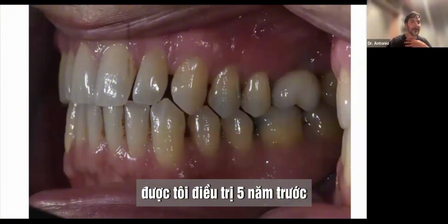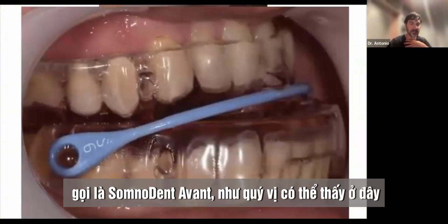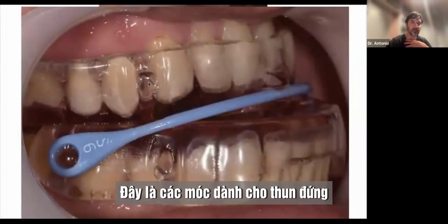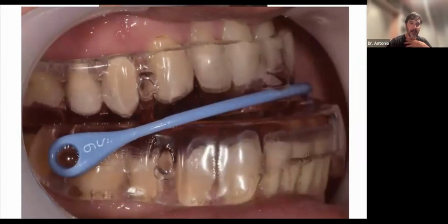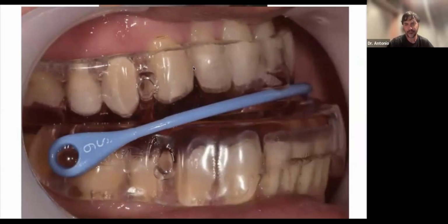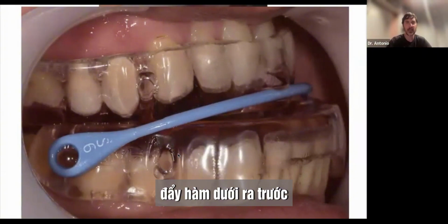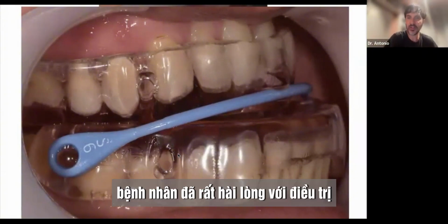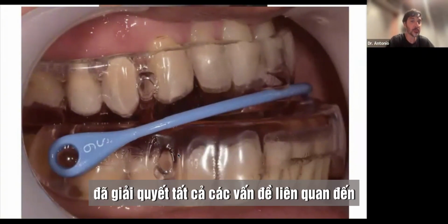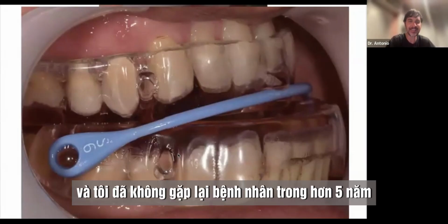It was treated by me 5 years ago with this kind of device. It's called the Somnolent Avant. As you can see here, these are the hooks for the vertical elastics. And using this kind of device gives the patient the opportunity of pushing the mandible forward. He was so happy with the treatment, he solved all his problems concerning snoring and apnea, and I didn't see the patient for more than 5 years.